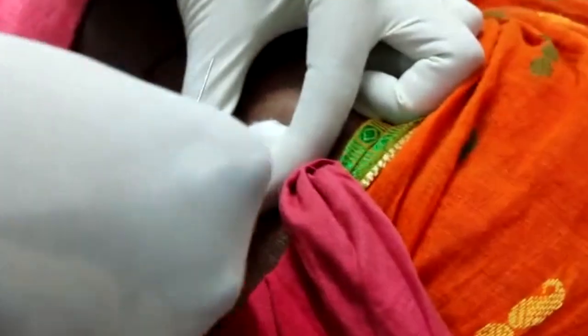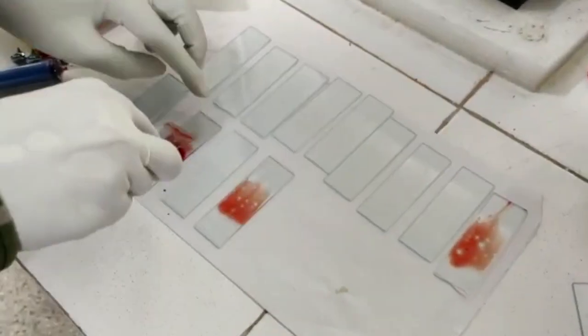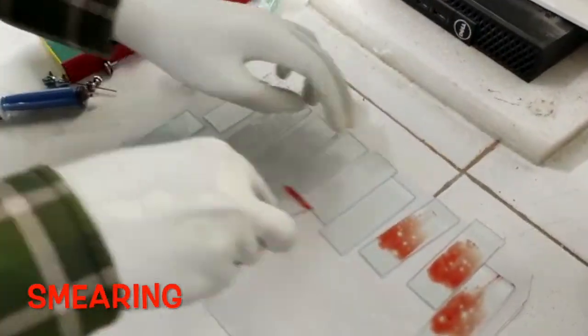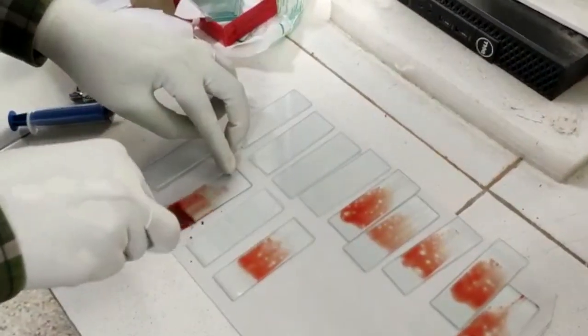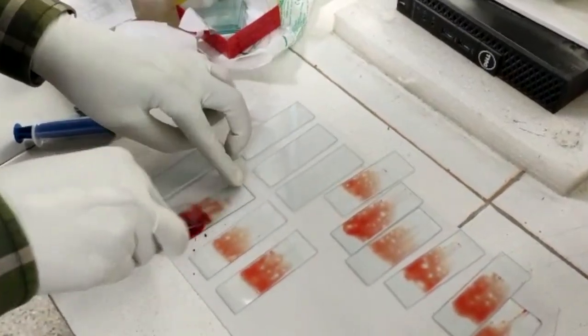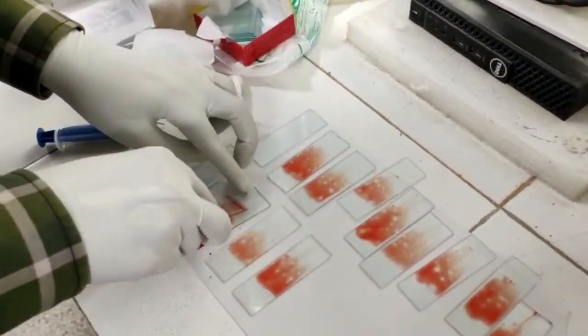As fast as possible, we have to make the smears, as you can appreciate in this clip. This is to prevent any kind of clotting. We are making the smear by the classical wedge method, and it is very important that we make a lot of slides.